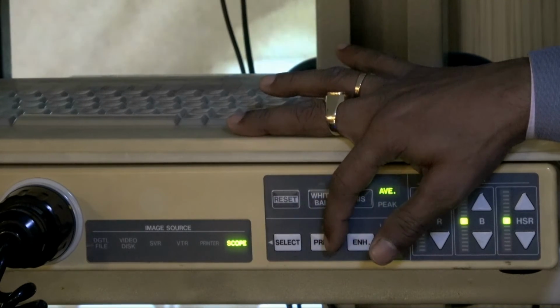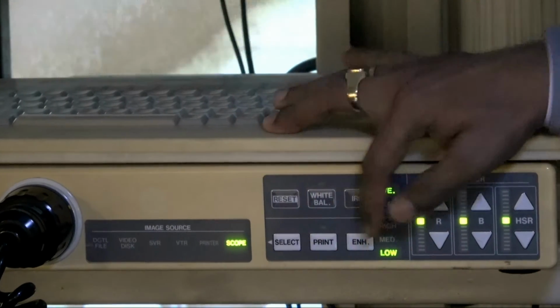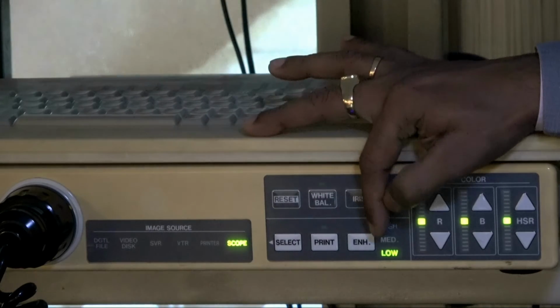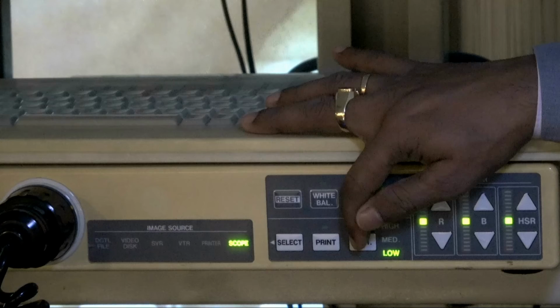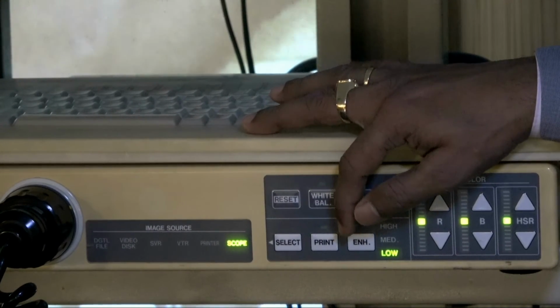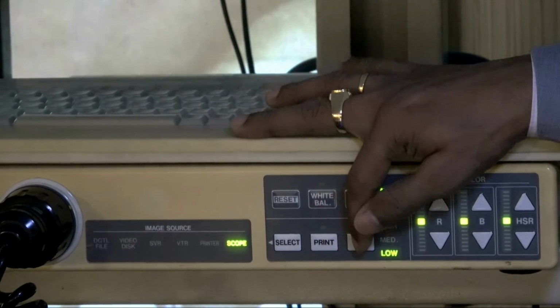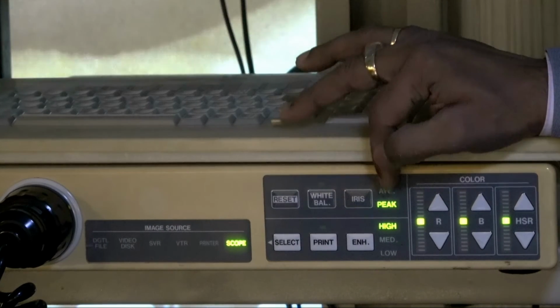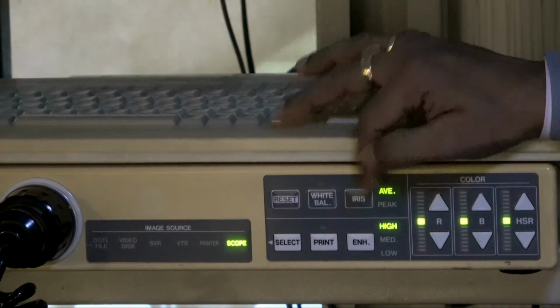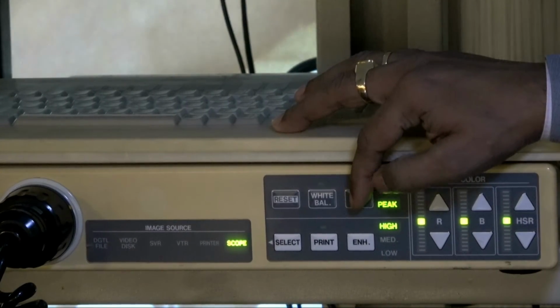The page which you have paused, you can freeze the image with your finger button, and then you can print. This is for digital enhancement: low, medium, high. If you are performing surgery and want it a little brighter with more digital pixels, you can press it for digital enhancement. This is the iris. Normal iris is average; if you want to change it, it will go to peak. That also will improve the quality of light.